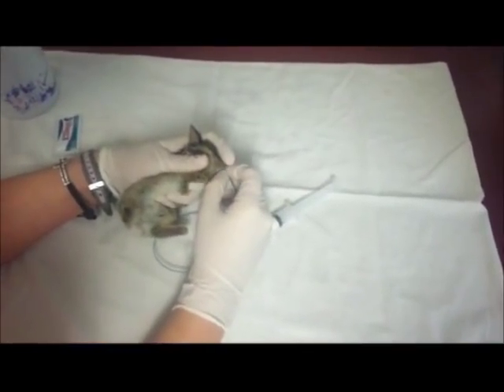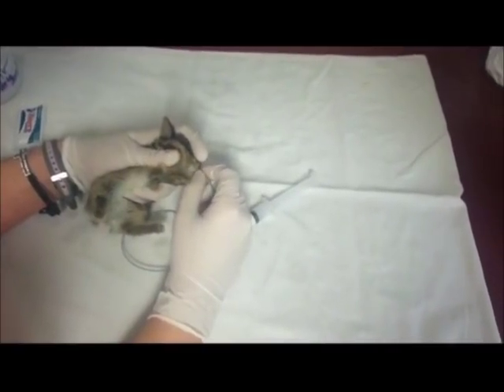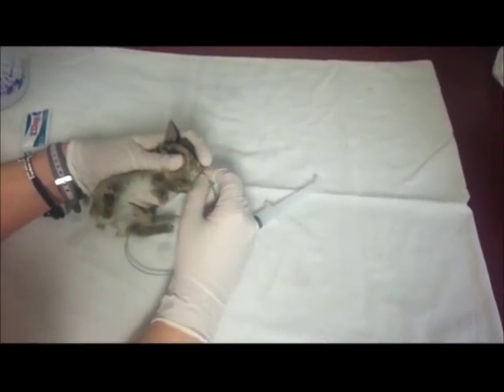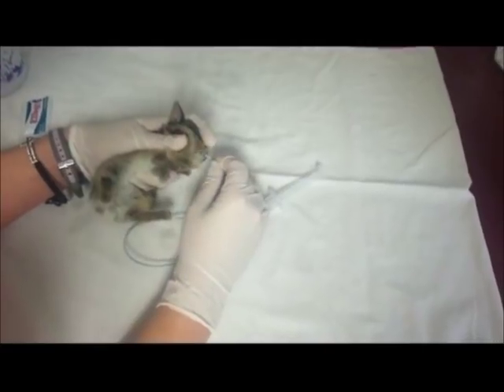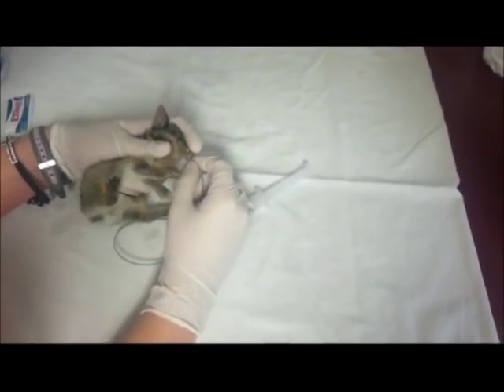You may feel resistance at first from the cottontail biting down on the tube. If the tube will not go all the way down to your mark and you feel heavy resistance, you may have entered the lungs. Pinch the tube and slowly pull the tube out and refer to the primary rehabber.